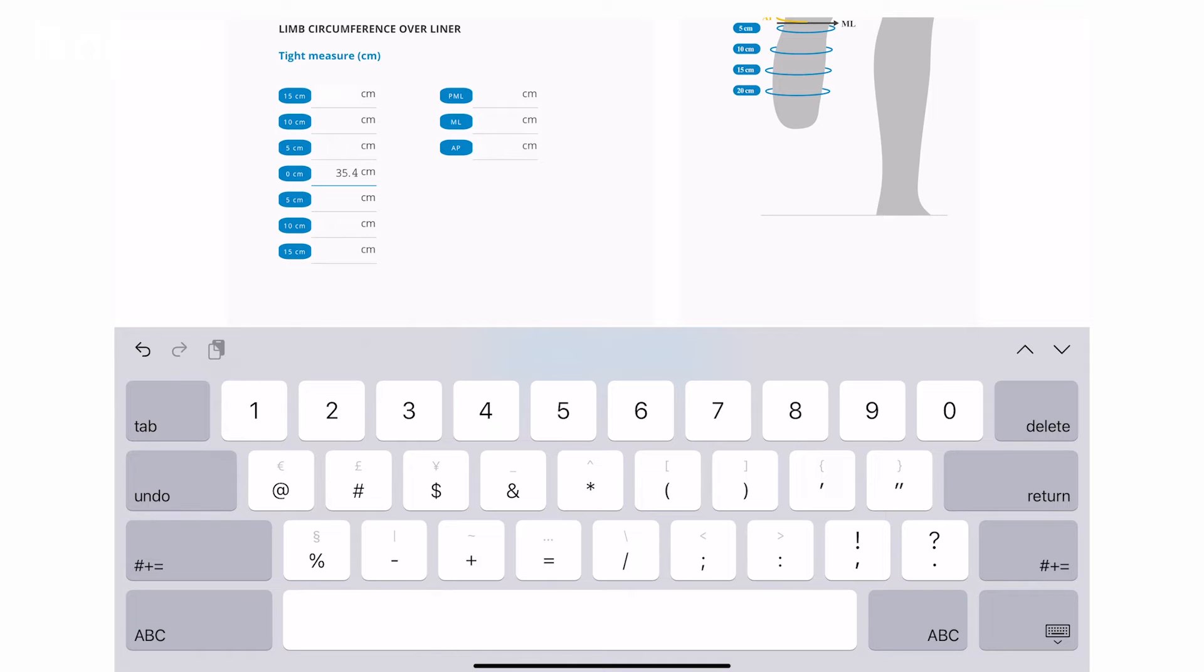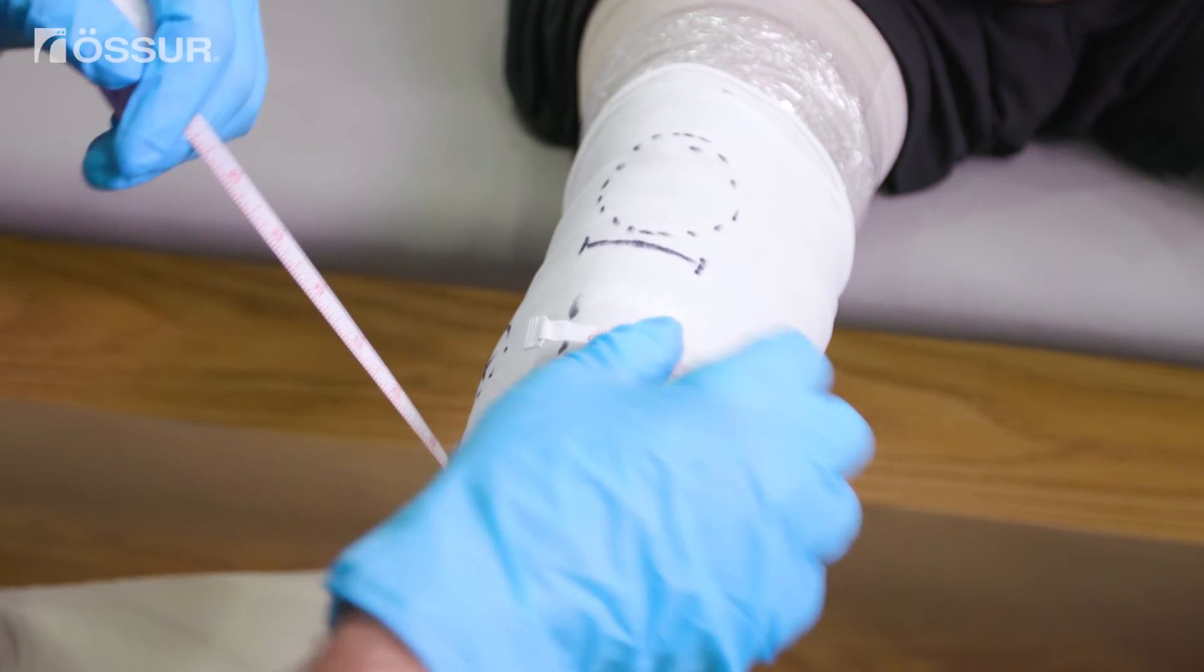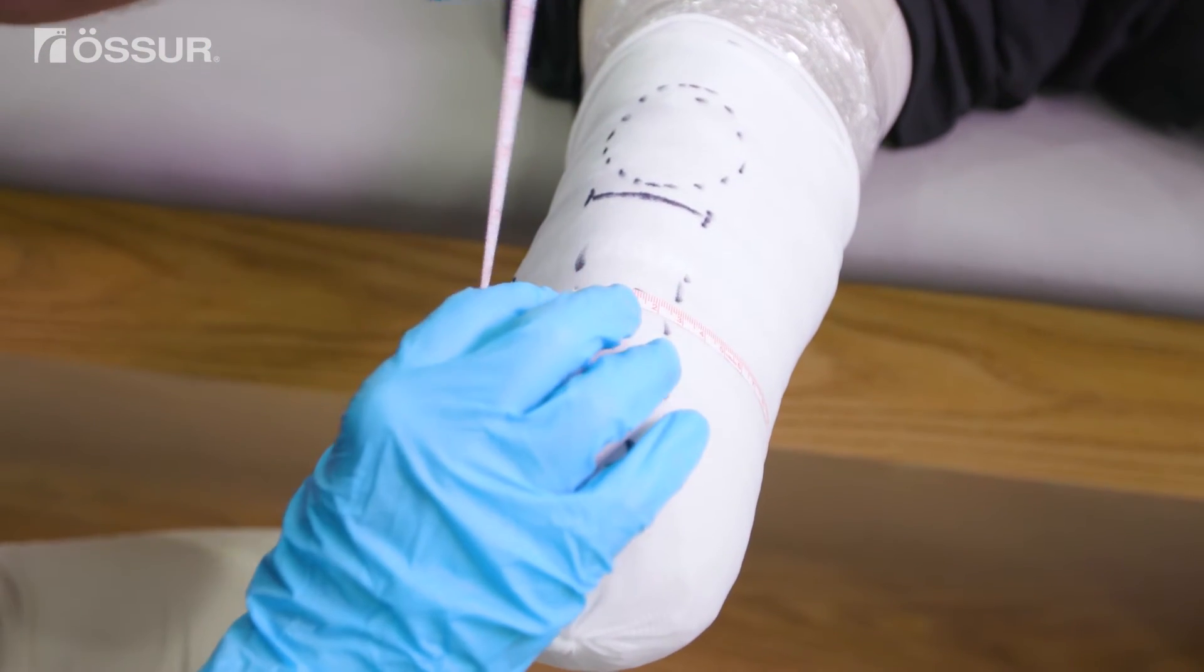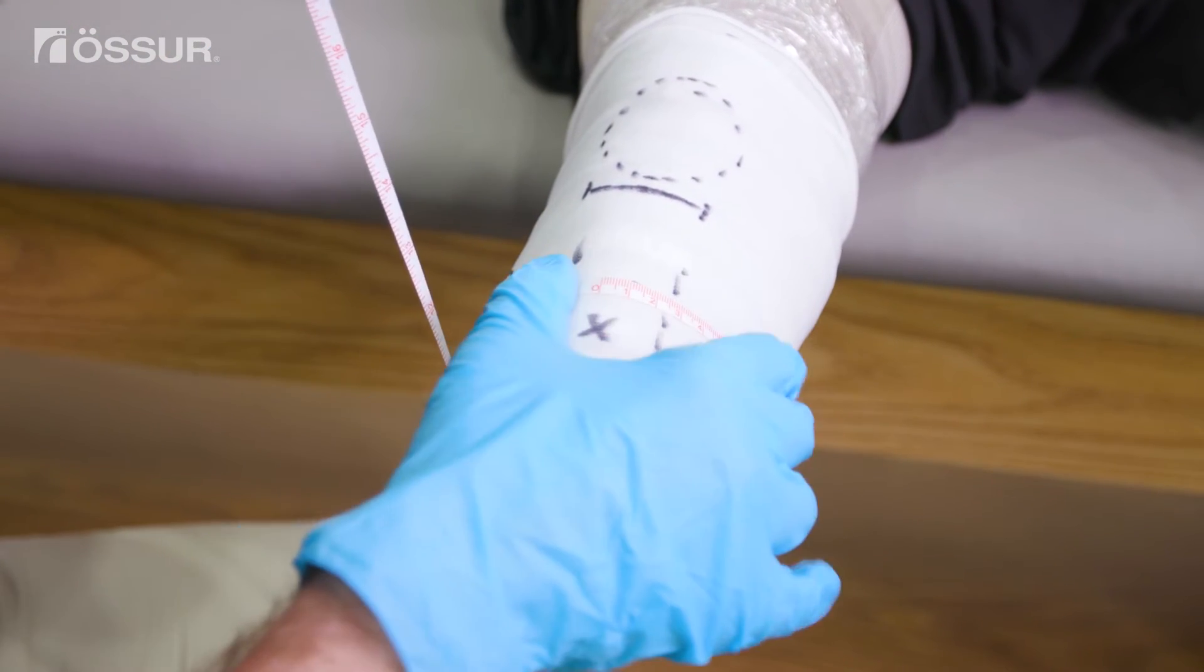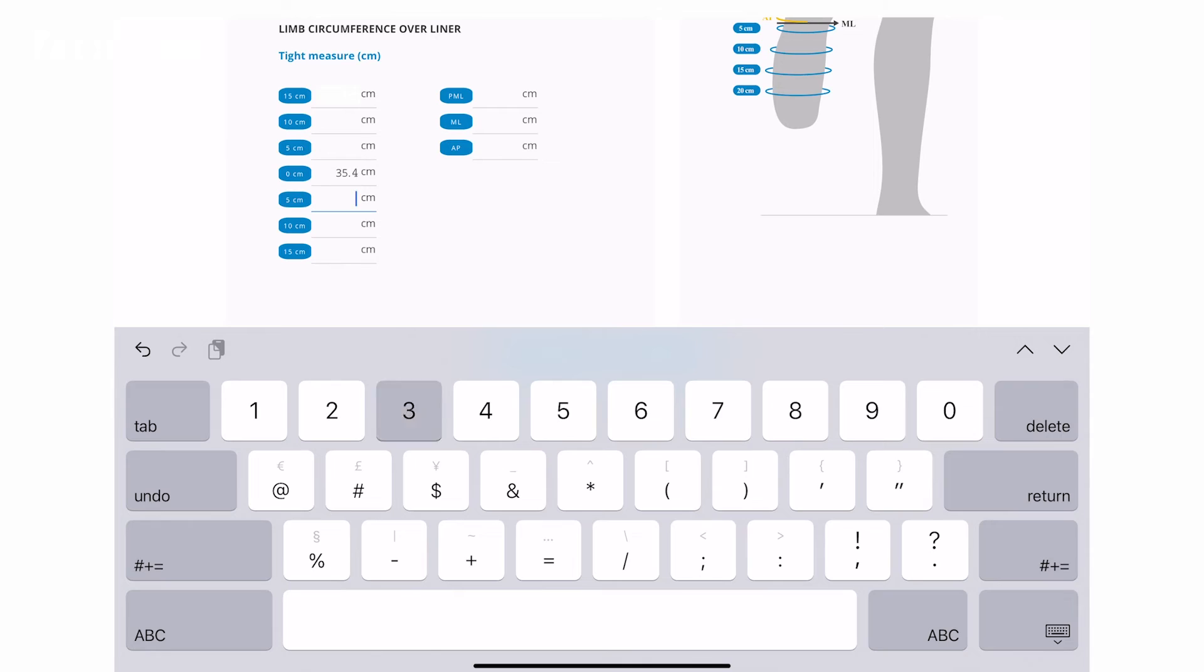Once entered, select the next field in the portal and measure the next marked location. Again, be consistent each time with how you measure the circumference. For this location, the circumference is 35 centimeters. Input that measurement into the portal.